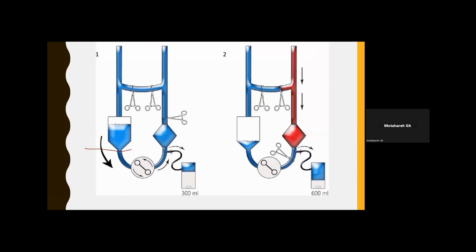arterial line was clamped. Also, after atrial cannulation, the venous line clamp was released, and the prime solution in the venous line was replaced with the patient's blood, and the prime solution gathered in the collecting bag. This process should be done slowly to prevent hypotension and arrhythmia. This method requires collaboration between the surgeon, anesthesiologist, and perfusionist. If the mean blood pressure reaches below 60, an inotrope will need to be injected.